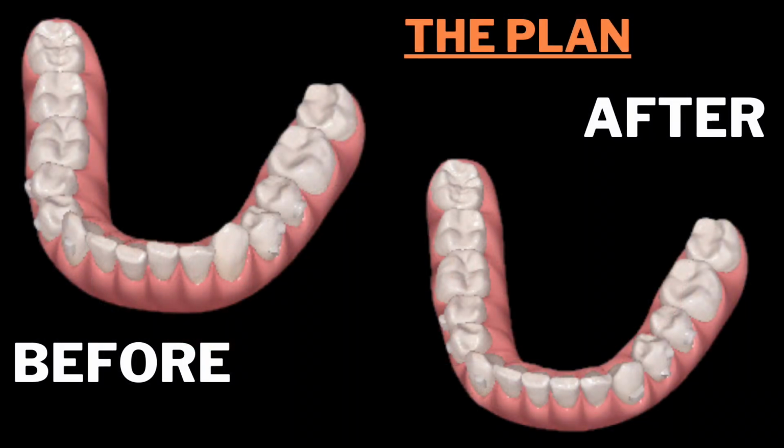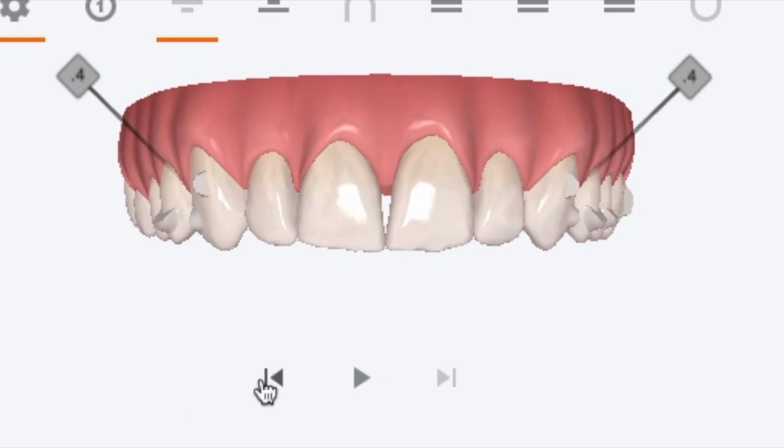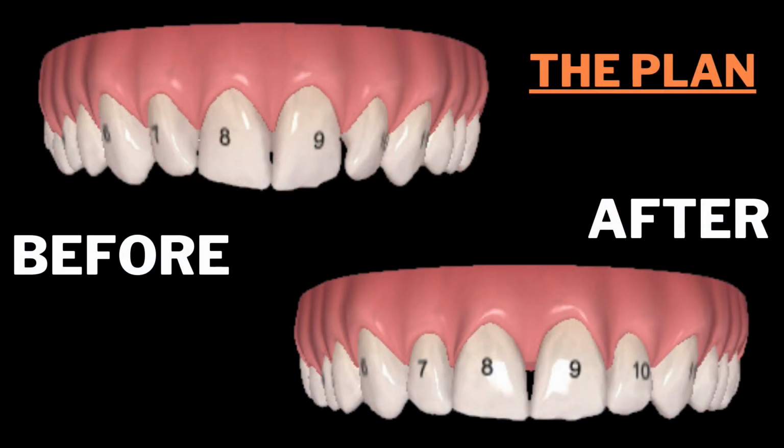And I got a tilted view so you can see how the teeth are all kind of crooked, off kilter, like they're on their own little journeys. After, everything is lined up so nicely.